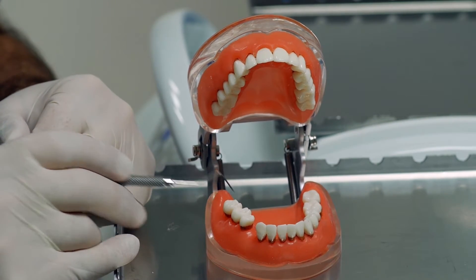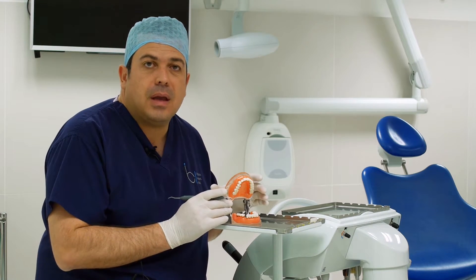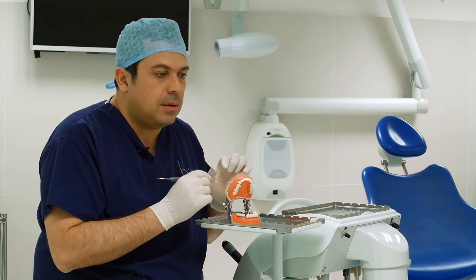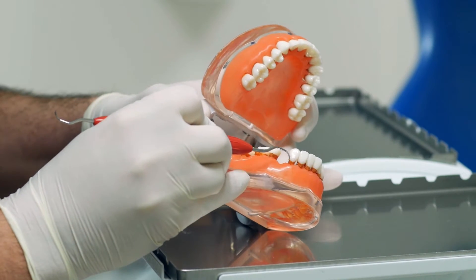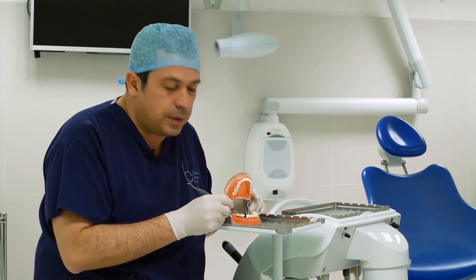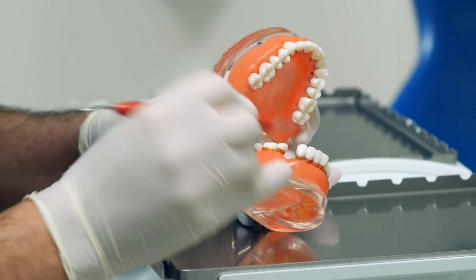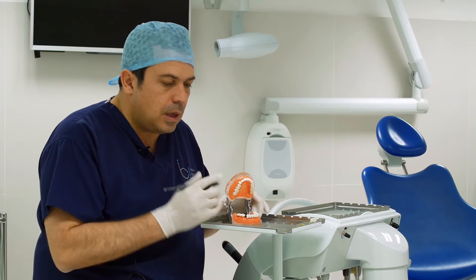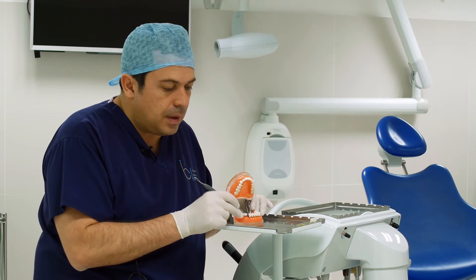A periodontal probe is used to detect how progressed the gum problem is. More commonly we use a piezo scaler — a machine that vibrates the tip at ultrasonic level at a very high frequency — which is actually a lot more comfortable. It has a small water irrigant to help flush the cleaning process while the hygienist or dentist cleans your teeth, removing plaque and tartar.